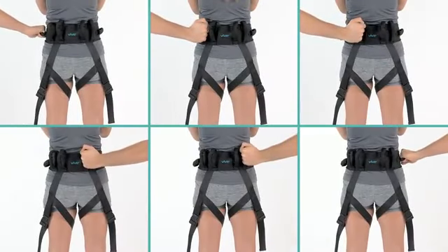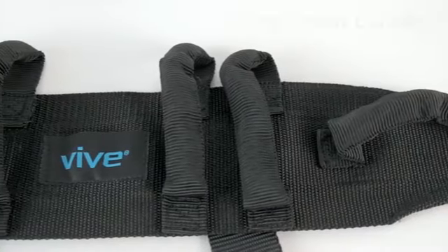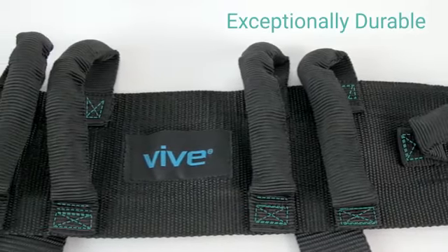Reinforced padded handles provide a comfortable grip and allow assistance from any angle. Strong nylon webbing features reinforced stitching for exceptional durability.